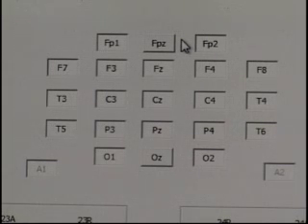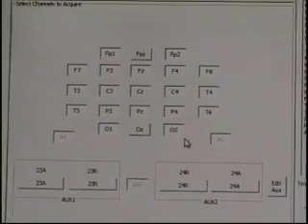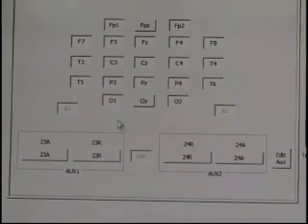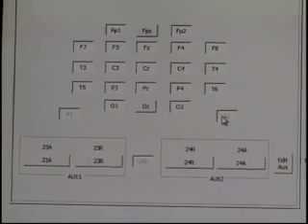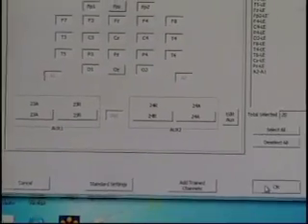If you depress them and there's no electrode there, they're going to introduce a lot of noise, and you're going to see this noise on the screen and not realize that it's just simply an inactive channel trying to acquire but with no electrode. Okay, so this is all prepared for your standard brain map. We see our 19 sites and our ground, our two references, which will be linked ears, and we say perfect. Okay.